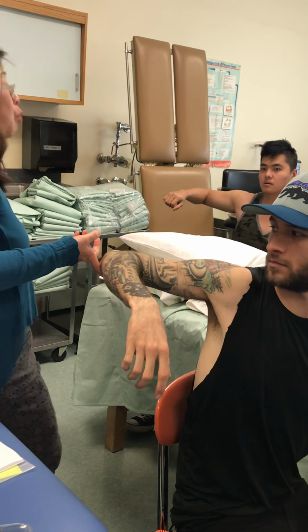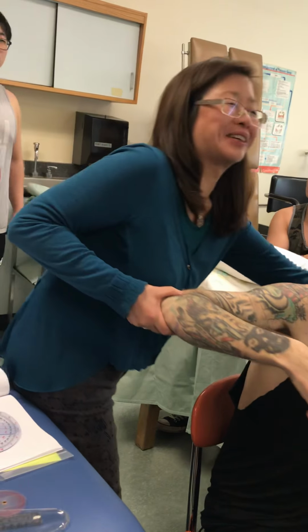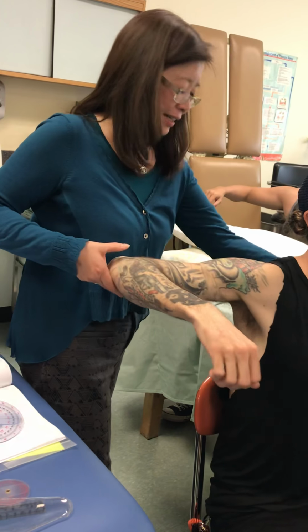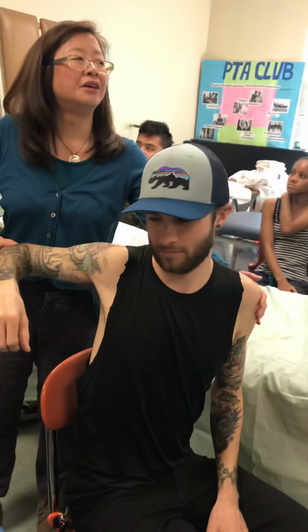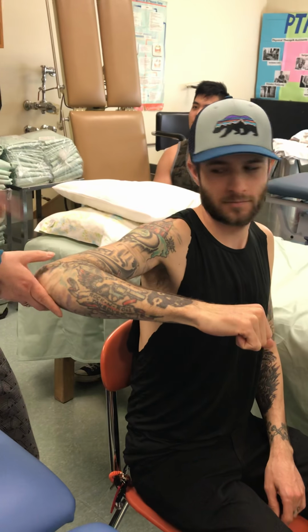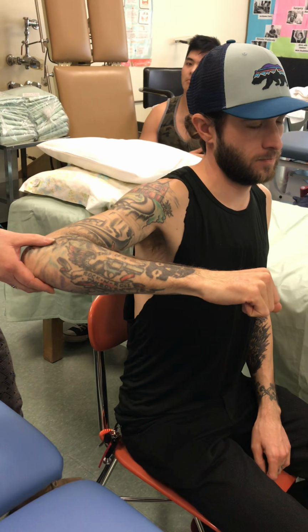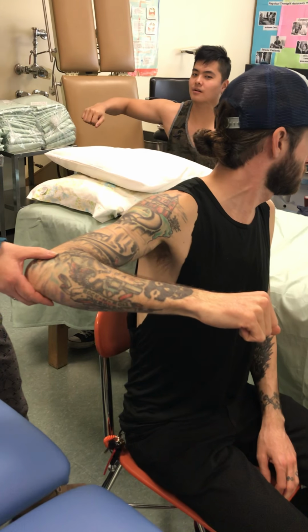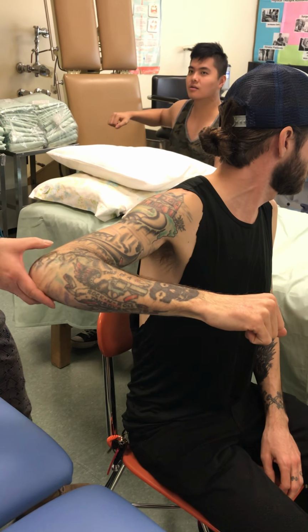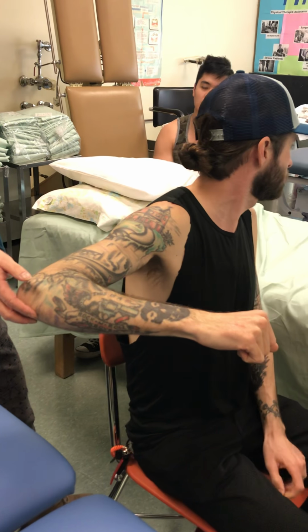And what else would I be careful to watch out for? Because what's he doing right now? He's twisting his trunk. I would be more concerned about that. If he's doing something like this, that's going to give him a lot more if I don't pay attention. I would be more concerned about him twisting his trunk than anything else. I thought you did like 30 degrees more, because I can stop here where I drop it. No, but I'm still lining it up to the midline of the humerus. Okay?